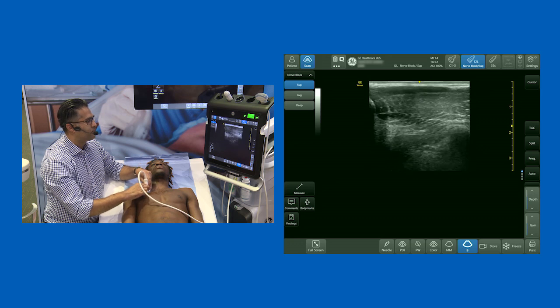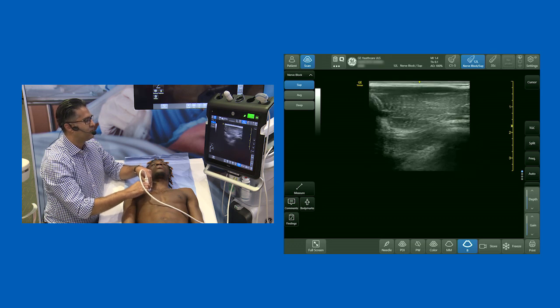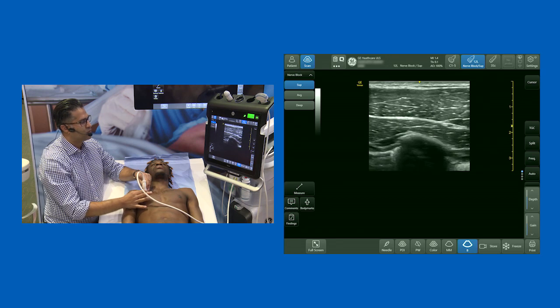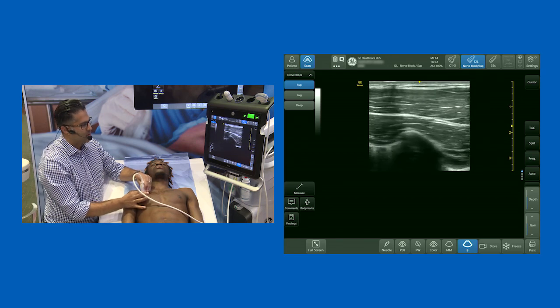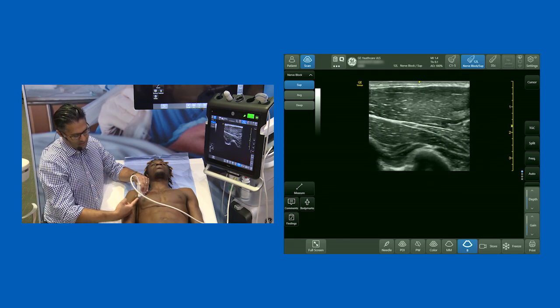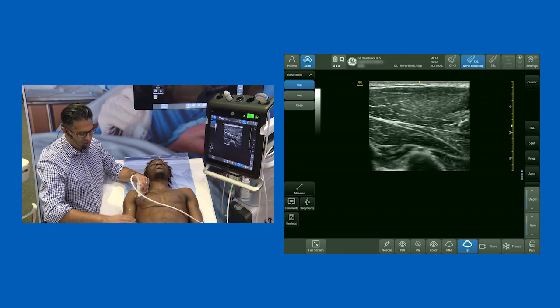So that is the sequence: clavicle, PEC major, PEC minor, second rib, third rib — get down to that point, rotate the probe around, and slide towards the axilla. The point of the PEC 2 block is essentially to fill local anesthetic down the lateral chest wall.